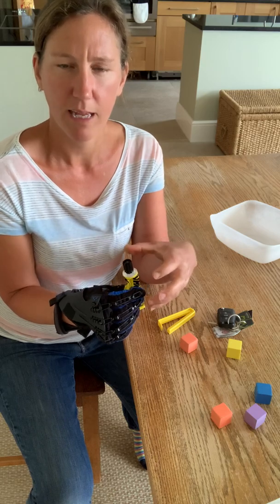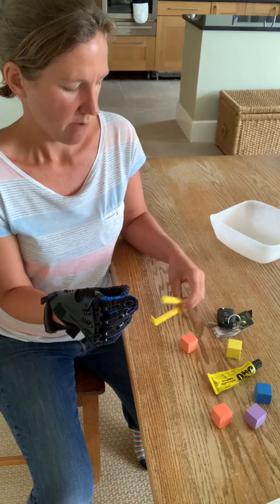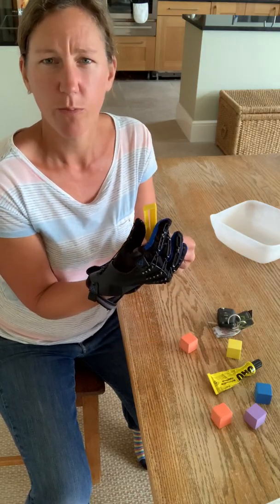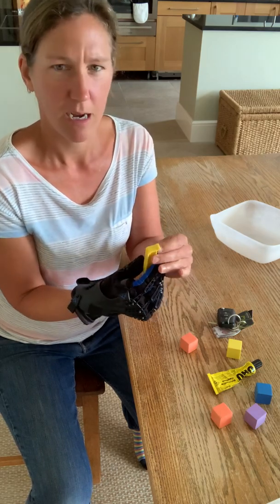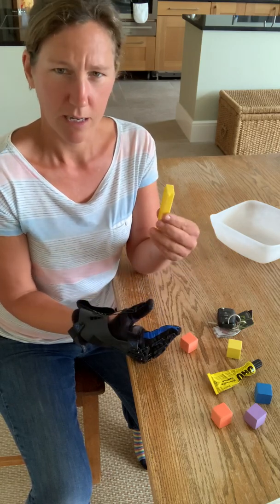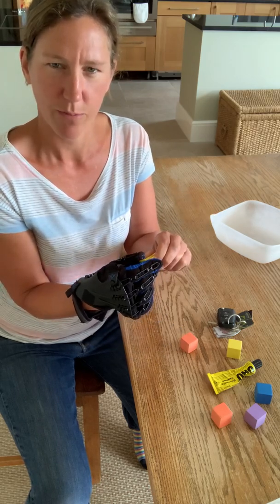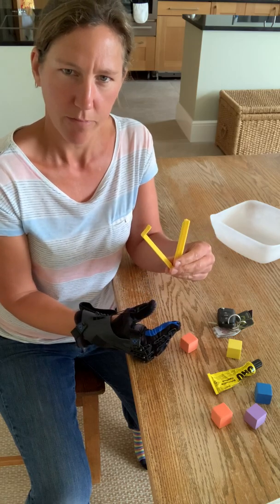It could also be a slightly larger object like a jam jar. I've got a plastic bag clip, so this is quite good, or it could be a clothes peg that you've got to practice squeezing together, and then I can unclip with my unaffected hand. Obviously if I swap over, I squash it shut with my affected hand, and I've got to try and open it up with the SaeboGlove. That will make it more difficult.